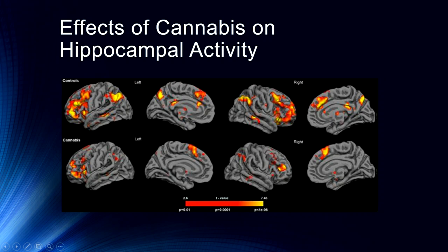And you can see here in the prefrontal cortex, a little bit of hippocampal activity. Looks like motor cortex actually looks like there's some effects here. And again, what we're seeing are the effects of cannabis. So we're seeing reduced functioning in some of these areas and increased functioning in others, or increased use in others, not necessarily functioning. And we'll get into some of these issues.